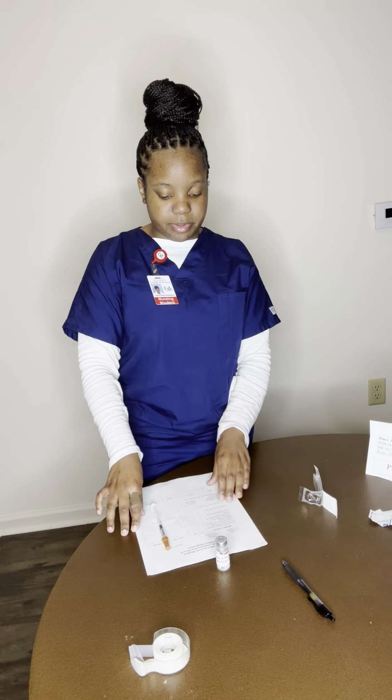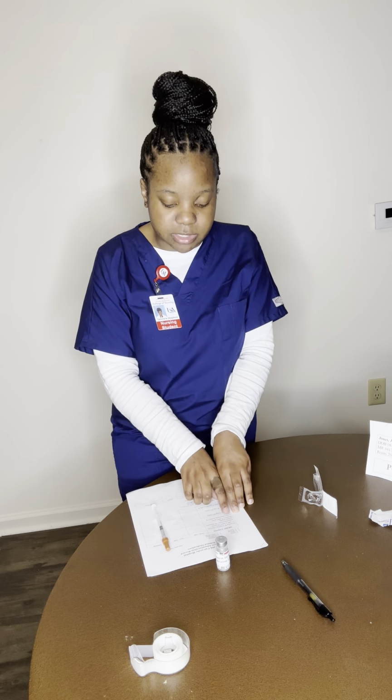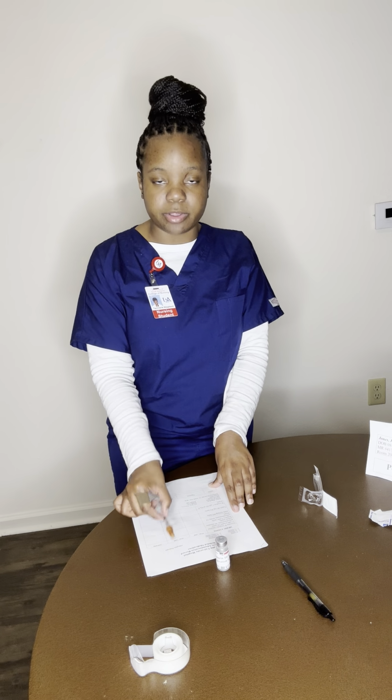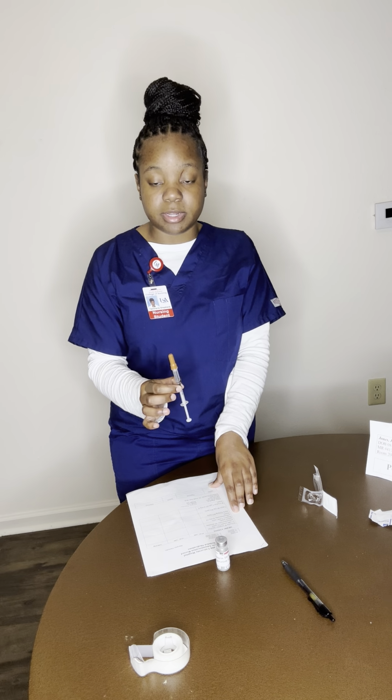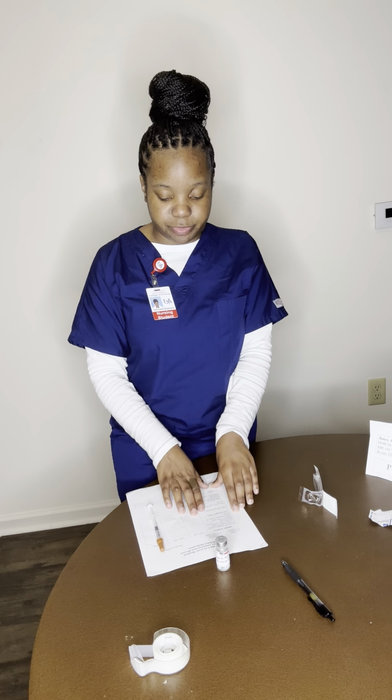So now I am going to move on to the right route. It is given heparin 5,000 units subcutaneously every 12 hours. So the route is subcutaneously, and we are using our TB syringe, 28 gauge, 1 milliliter syringe, which is used for heparin.